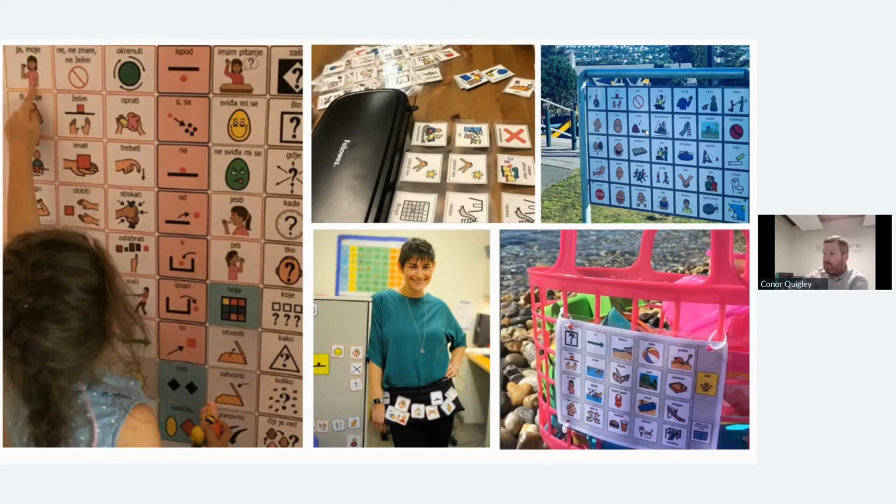So there's a lot of county councils that started to put these into public playgrounds and parks, as communication boards using these PCS symbols. Then you're going to the beach and you can't bring your high-tech device into the water, so you create a little communication board for the side of your little basket that you're bringing down to the beach, and so on. So there's lots of different applications. I'm sure some of you working in classrooms and speech and language therapists will have loads of examples of other applications that you've seen them use.